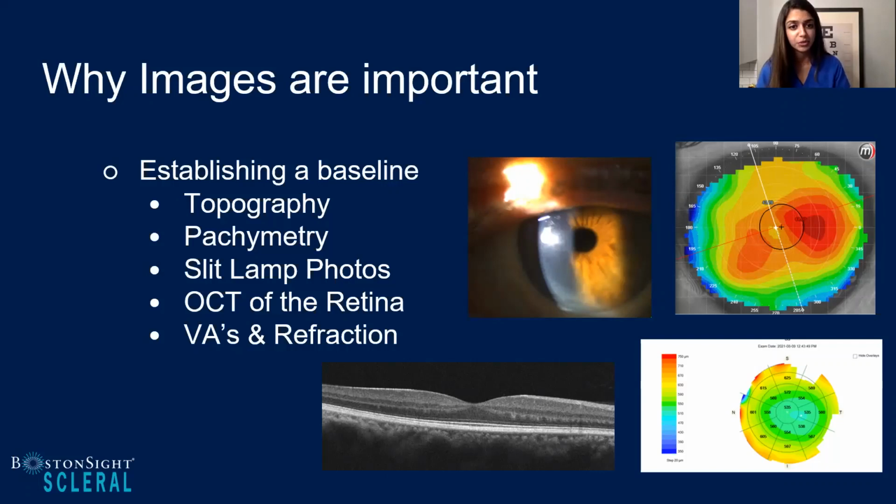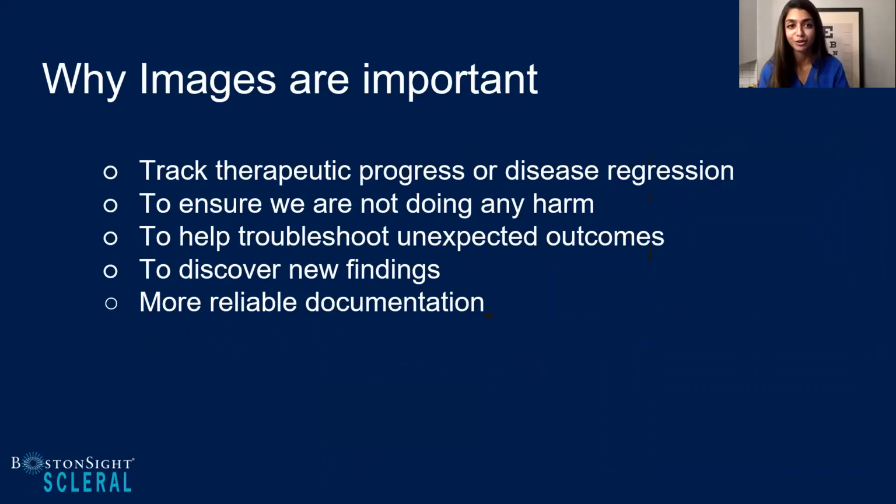I think the beauty of taking photography is also being able to monitor disease progression or regression and the therapeutic success. Oftentimes we fit scleral lenses because we're managing some type of corneal pathology. And like you mentioned, we want to ensure we're not doing any harm, but also the goal is that we use these images to help us troubleshoot.